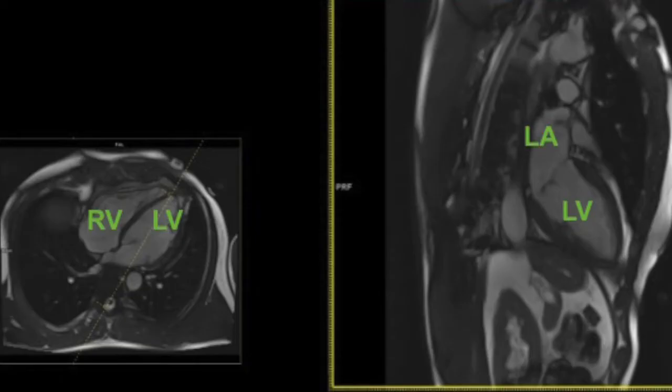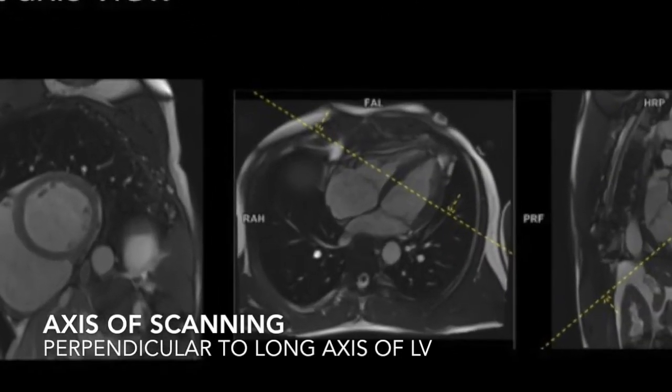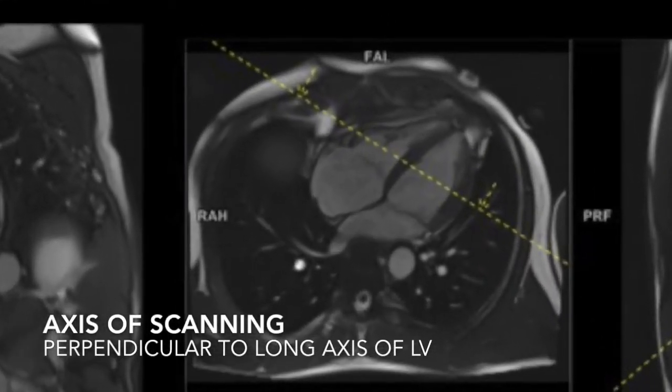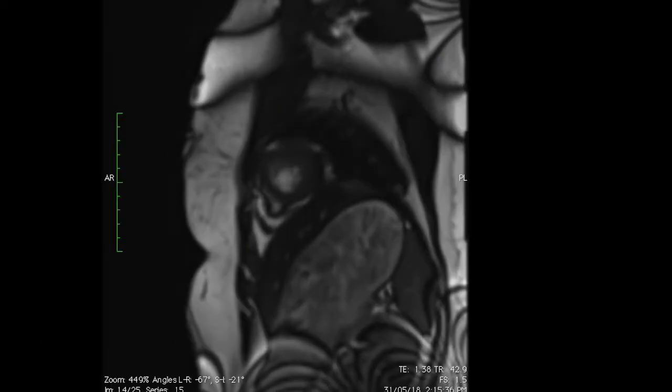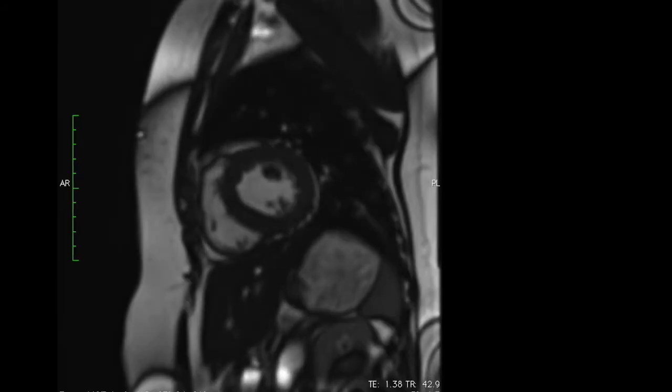Then we derive the short axis view. This is perpendicular to the vertical long axis view and is acquired as a stack from base to apex.